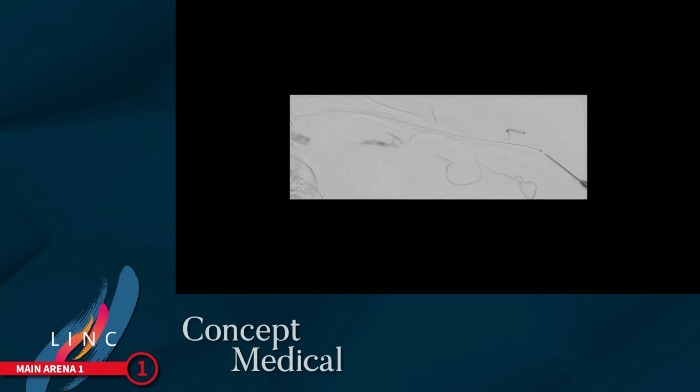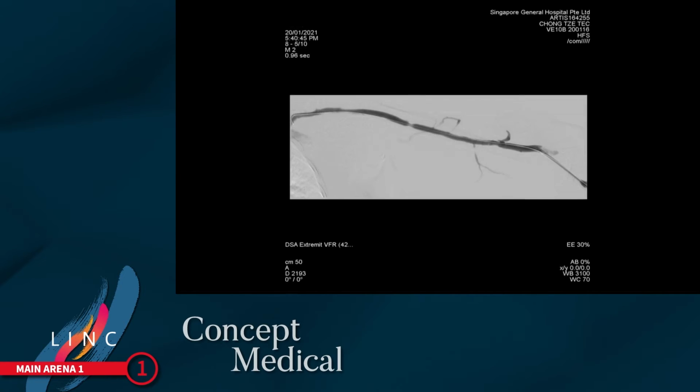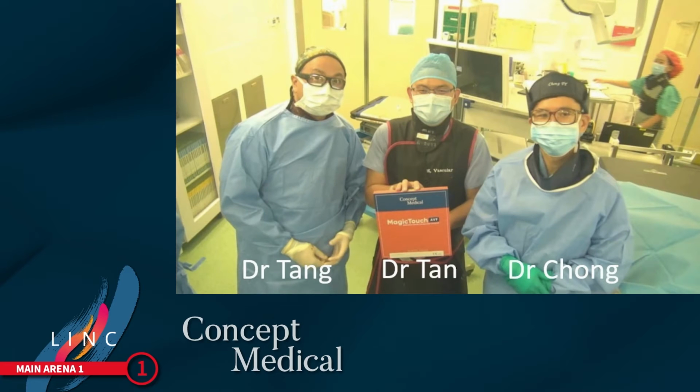You can see the brachial artery is no longer being lit up. There is a bit of stenosis, but I think this is spasm because we compared it to the initial angiogram, and it shows that this lesion wasn't there before. In general, we do not go about chasing these kinds.